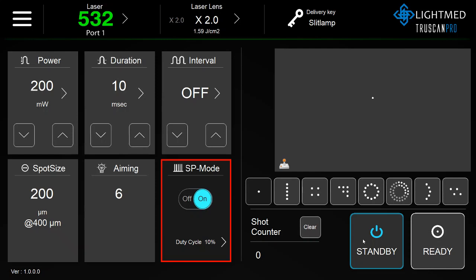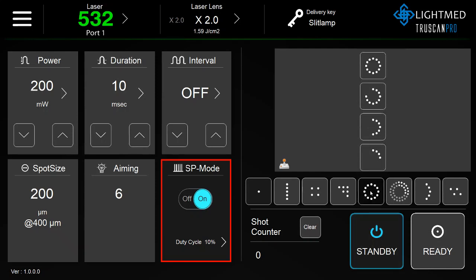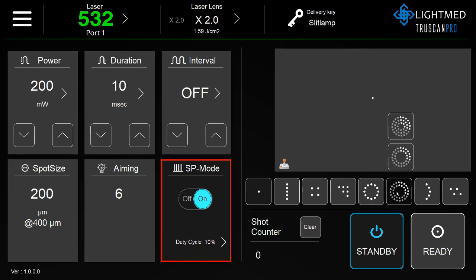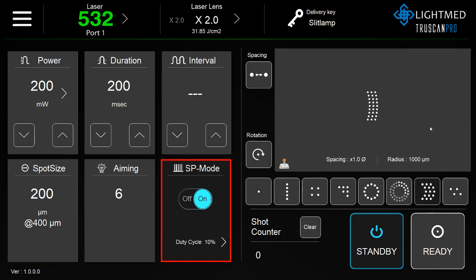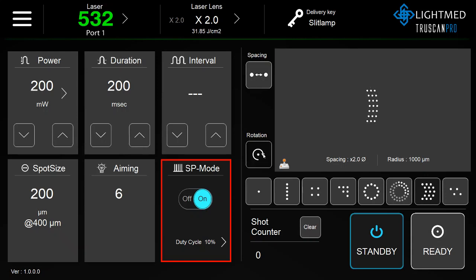Next, we select the pattern for treatment. Each pattern has multiple configurations. You can adjust the spacing of the pattern, and adjust the rotation.